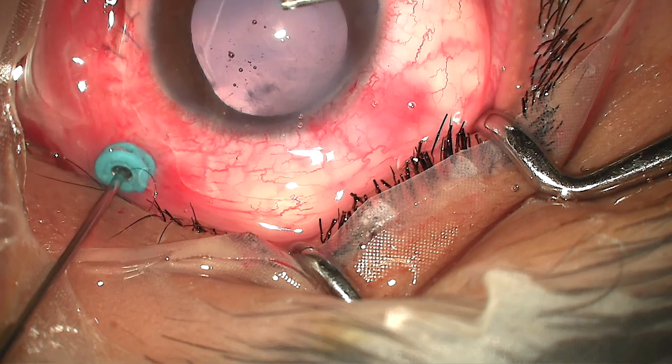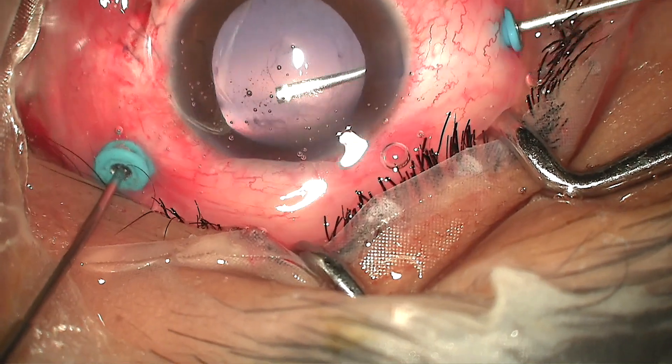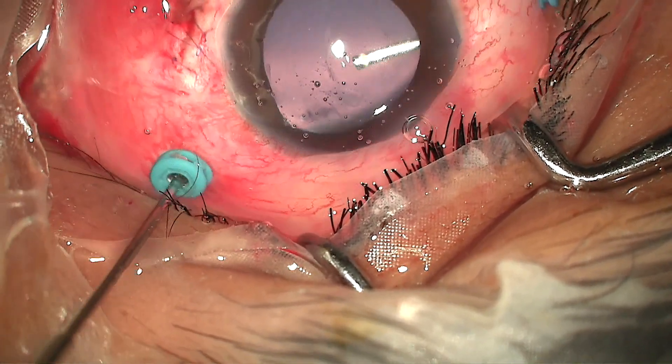As the vitreous hemorrhage was getting cleared, to my utter surprise, I could see a large concealed foreign body in the superonasal quadrant — a non-metallic large foreign body standing upright in the superonasal quadrant of the retina. I cleared the vitreous around the foreign body as much as possible and then performed a large posterior primary capsulotomy with the cutter for removal of the foreign body.